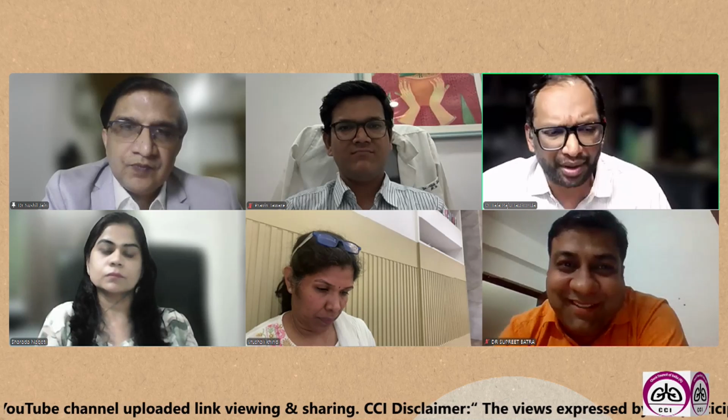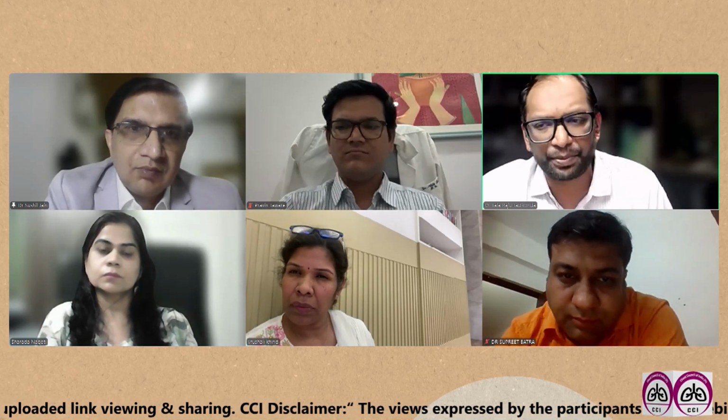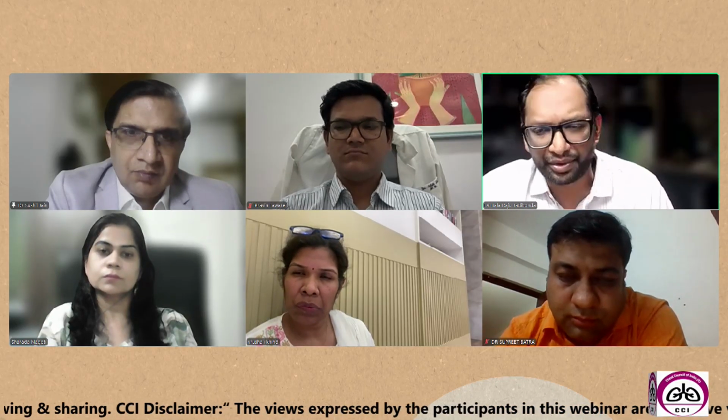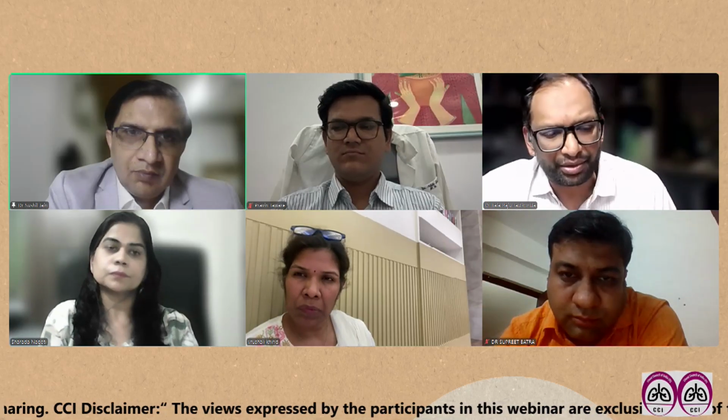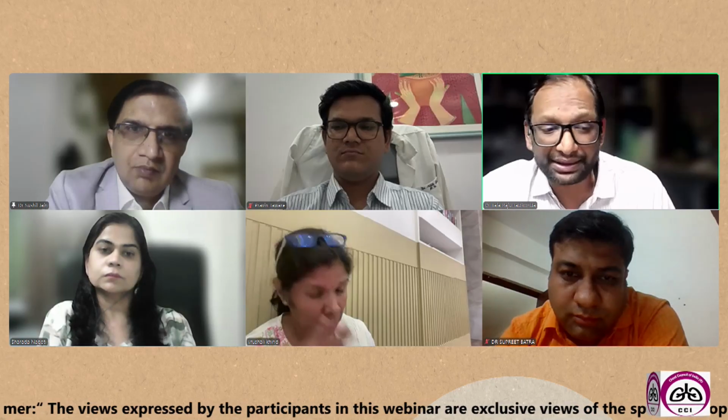Yeah. So the commonest causes for non-diagnostic EBUS are, one, wrong nodal selection, or the wrong part of the node being selected. Two, probably too few passes, or the technique is entirely wrong.